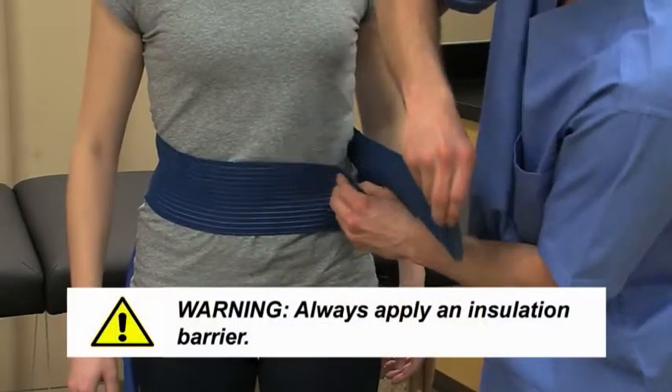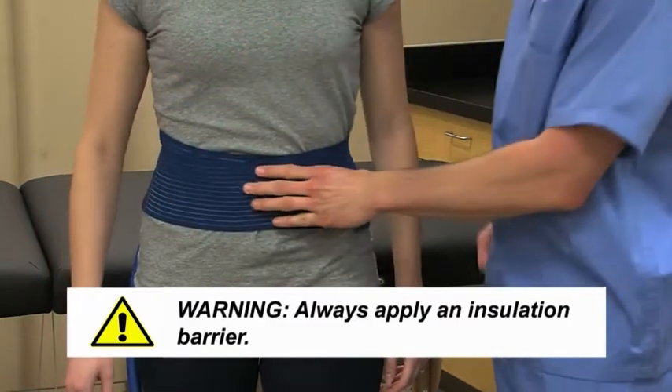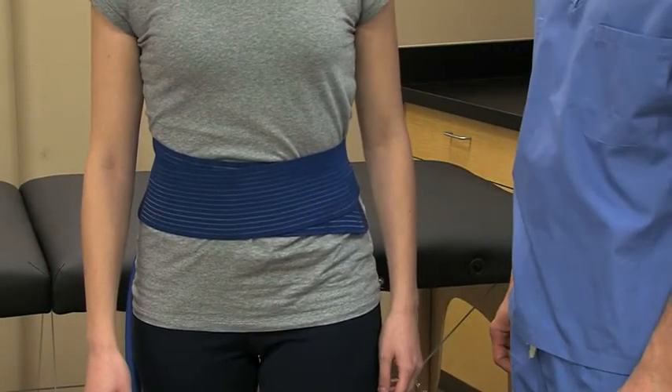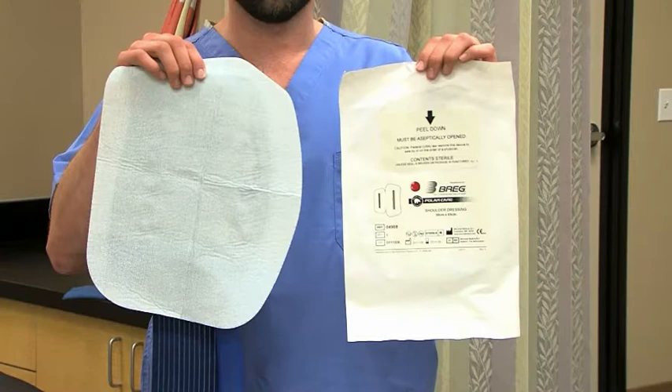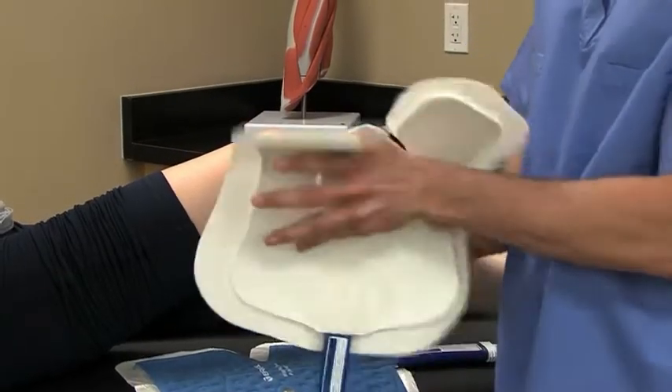To apply the pad, always use an insulation barrier that prevents the pad from directly touching the skin, like a Breg Polar Dressing, WebRoll, Curlix, Cast Padding, or an elastic bandage. Breg Polar Dressings provide a sterile, water-impermeable insulation barrier that covers the entire surface of the pad and includes a self-adhesive strip for easy application.